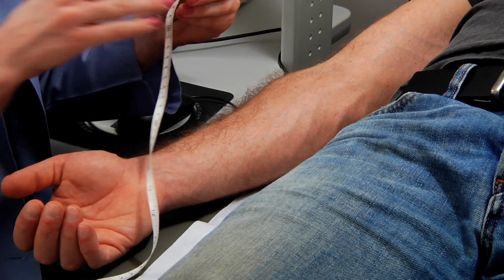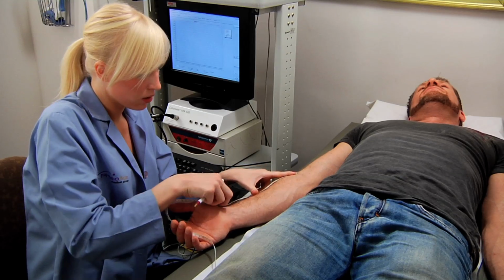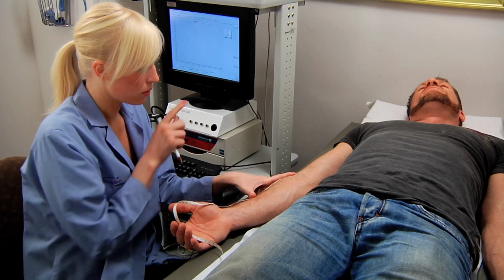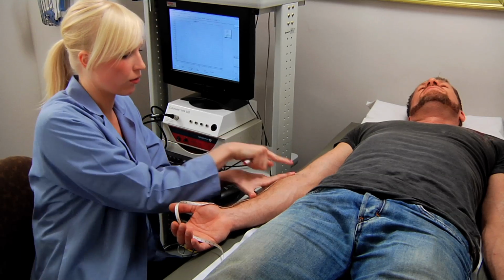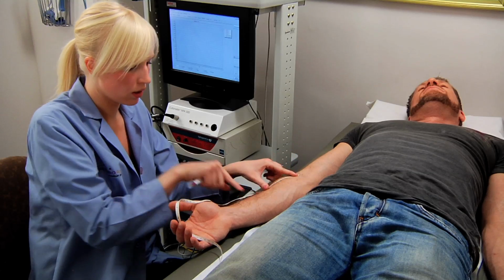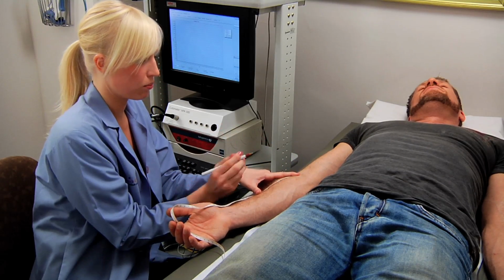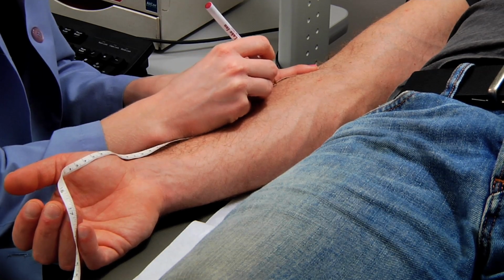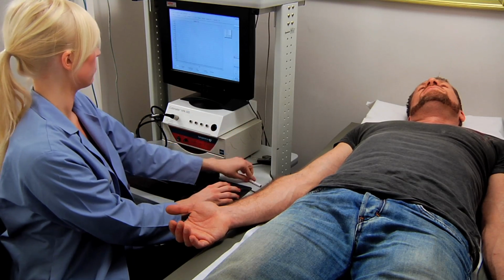First, you're going to measure their arm from the crease of their elbow to the crease of their wrist. So we measure from crease to crease because you're going to take the measurement for the skin elasticity test 1/4 of the distance from the elbow down the forearm, okay? So his forearm is 28 centimeters. So I'm going to place a dot with a pen at 7 centimeters because that's 1/4 of the distance from his elbow.